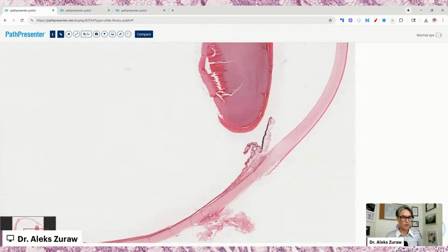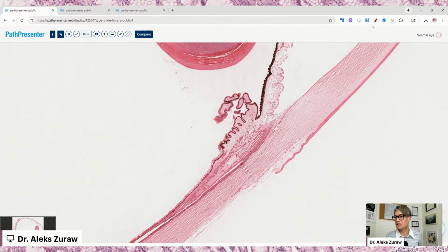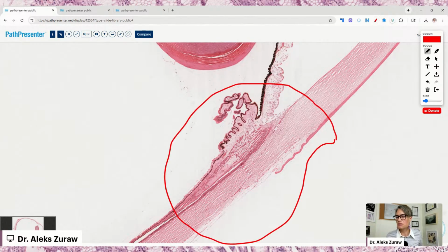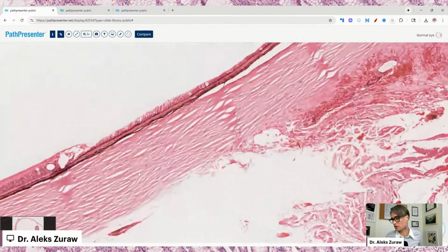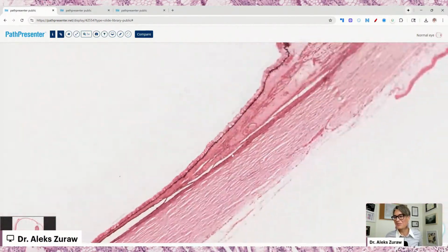So, and then they have this part where they join. This is the transition here, right here. This would be our cornea, and this is our sclera. And this transition from one to the other is called limbus. We have the ordered collagen, and this is supposed to be a little bit less ordered. Honestly, to me, it's ordered as well. But maybe somehow it is not.